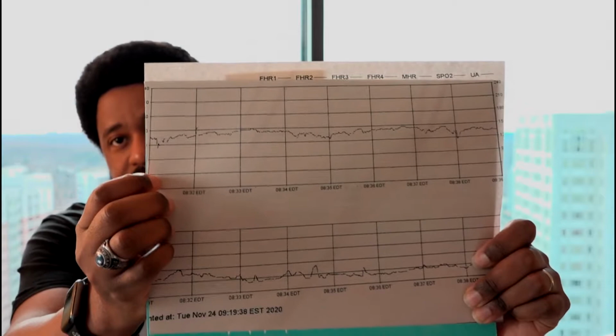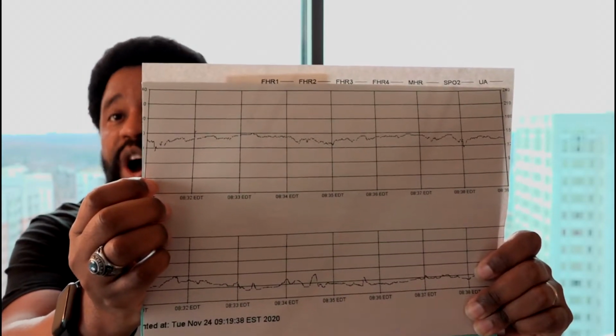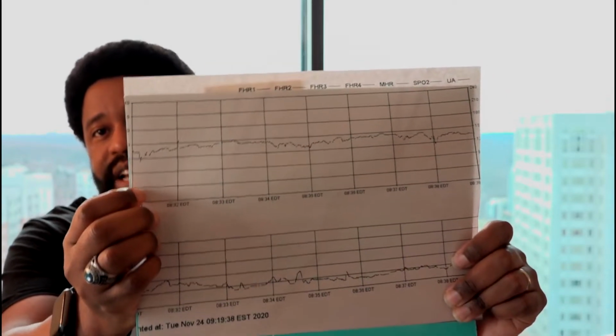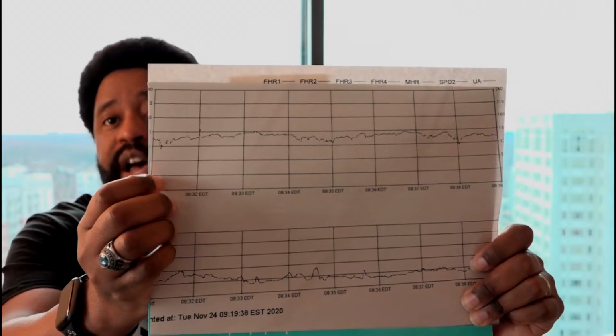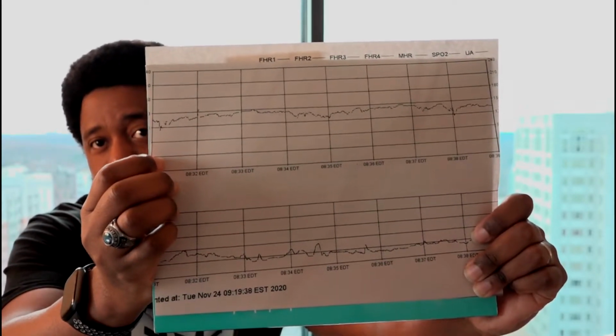You've got two sets of lines. As you can see, the top line deals with the baby's heart rate. It's going to be looking at variability and acceleration or deceleration patterns. The bottom part is going to be mom's contractions. So those bottom lines would be mom's contractions.